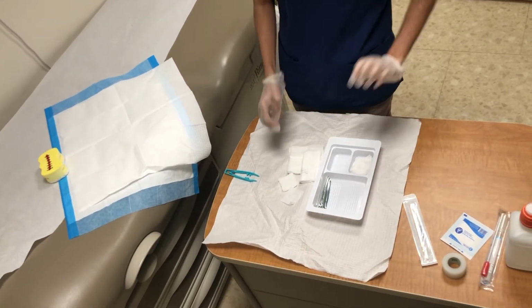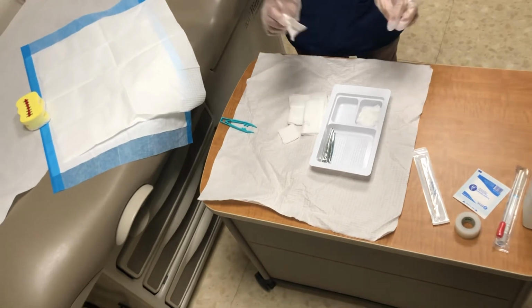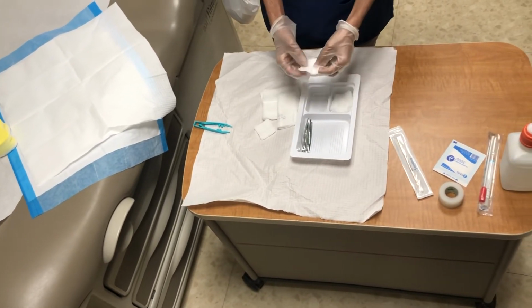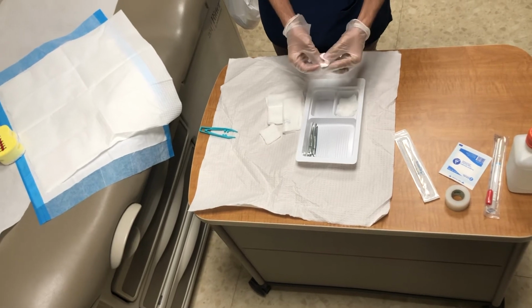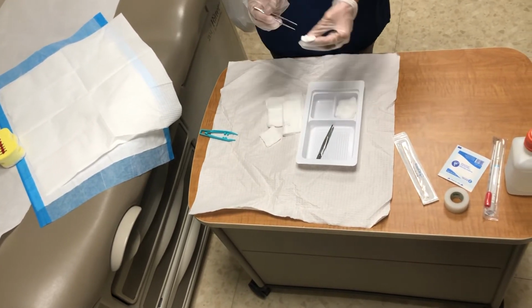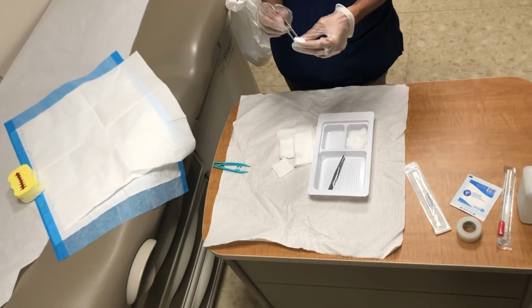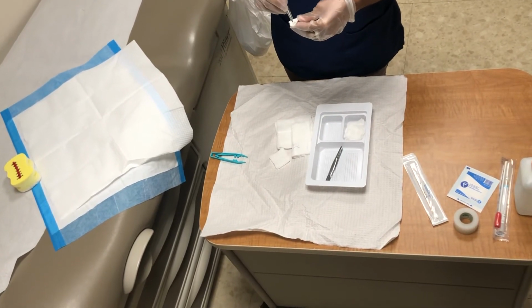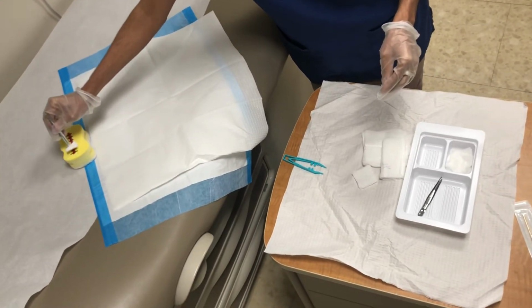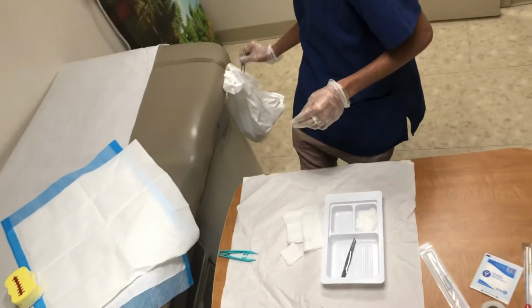And now that I have my solution here, I'm just gonna soak that. I'm gonna make it into a dumpling. I'm gonna squeeze it out. I'm gonna use my sterile forceps, and I'm going to clean the wound from least contaminated to the most. That's from the middle, top to bottom. And I'm gonna put that in my garbage.